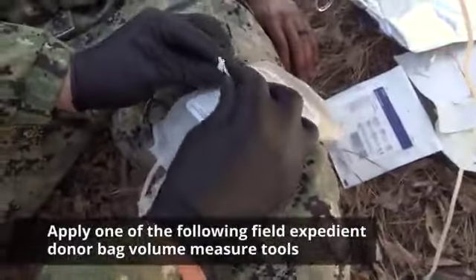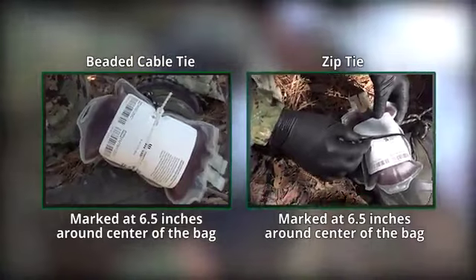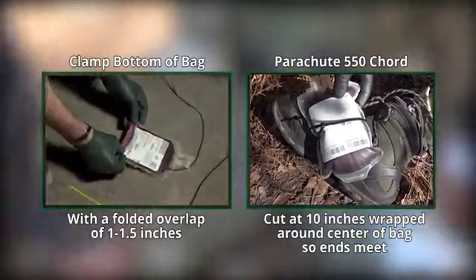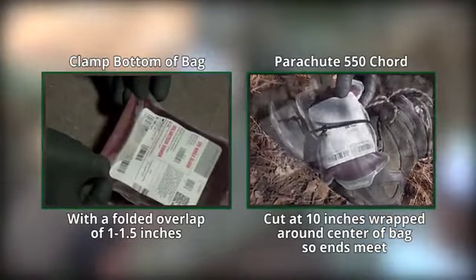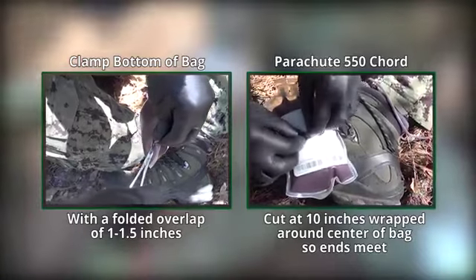Apply one of the following field expedient donor bag volume measure tools: a beaded cable tie marked at six and a half inches around the center of the bag, or a zip tie marked at six and a half inches around the center of the bag, or clamp the bottom of the bag with a folded overlap of one to one and a half inches, or use a parachute 550 cord at 10 inches wrapped around the center of the bag so ends meet.